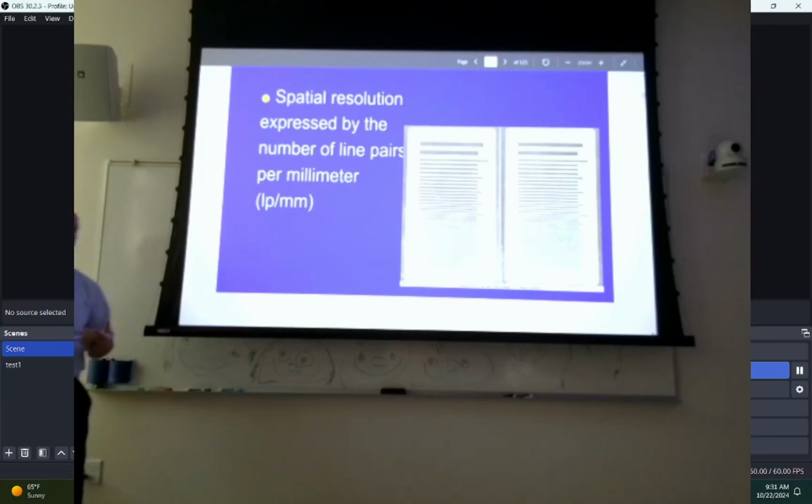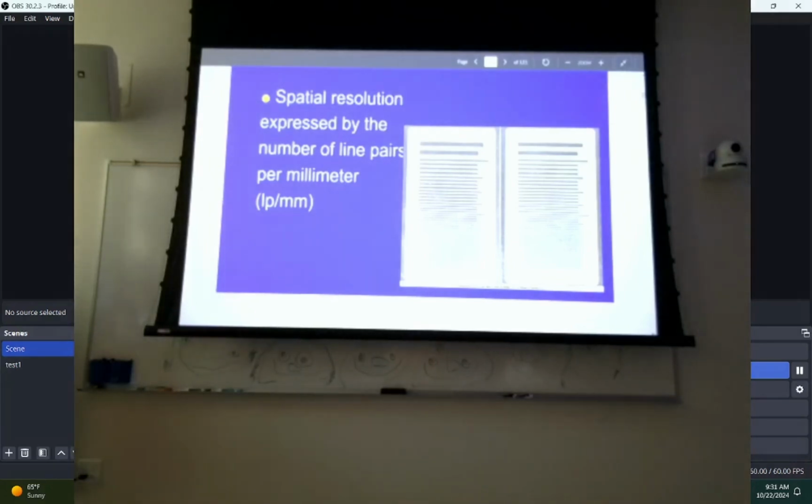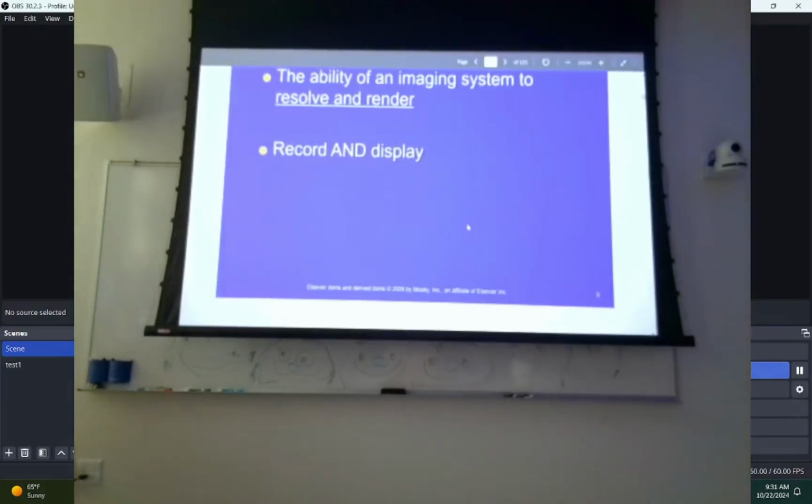Blooming issues, if you're holding the rotor down, that's not really a QA issue as much as it is an operator error issue. But anyway, this will test not just the focal spot size, but also the image receptor as well. The display is kind of loaded into the system. You can bring that up and take a look at it and see what your display looks like as well.